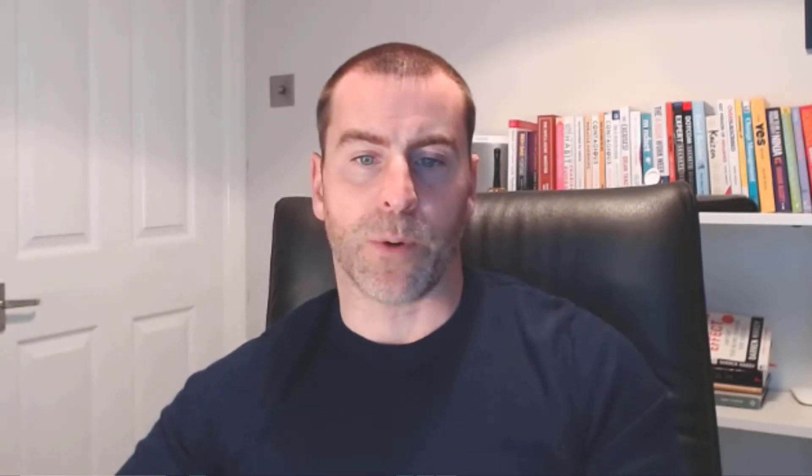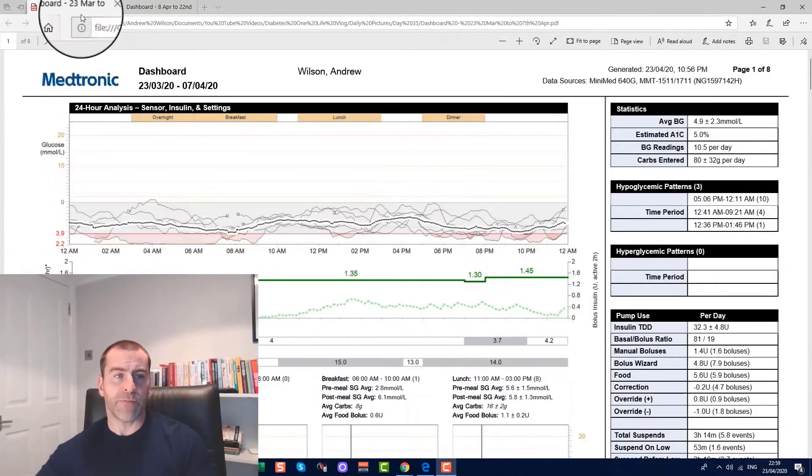I'm at the stage now where I thought it would be best to actually take a download of the information from the Medtronic CareLink site and analyze it. So what I've done is I've split it into two weeks, from the 23rd of March to the 7th of April—I've got three reports—and then we'd look from the 8th of April to the 22nd of April, the last couple of weeks as well.